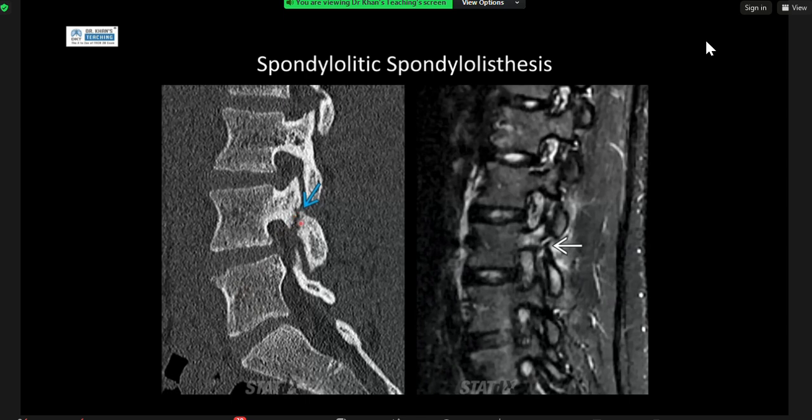It can be chronic, it can be acute on chronic. Then on your MRI, of course, if it's acute, you see more marrow edema and soft tissue changes, and if it's more chronic because something had happened and then things have changed, you see less of the soft tissue inflammation surrounding it. So often you see it in gymnasts or sports which need a lot of hyperextension, like baseball throwing. So, a past event.